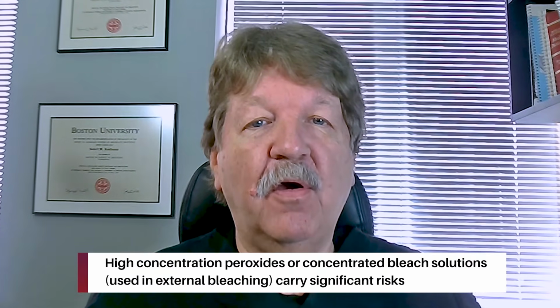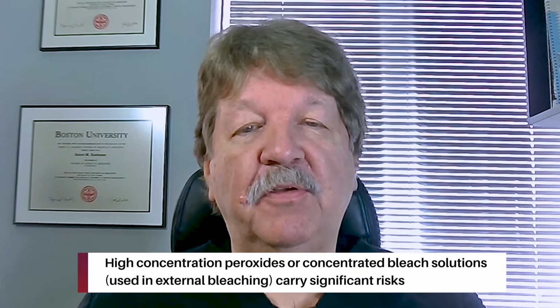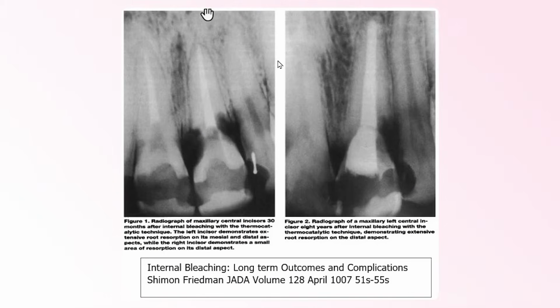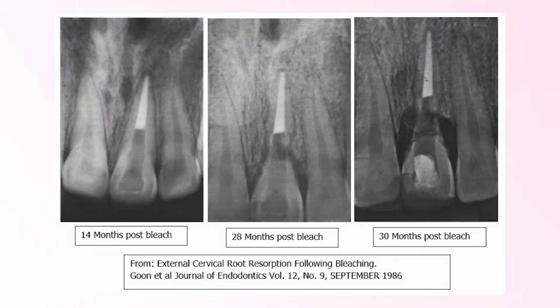After many years of research, we found that using high concentration peroxides, or some of the more concentrated bleach solutions that are used with external bleaching, has some significant risks. One of the most important risks we must be aware of is this leaching of the peroxide solution through the dentinal tubules into the pericervical area and the PDL. This can result in rapid, catastrophic, localized, or circumferential external cervical resorption due to the caustic nature of the peroxide. There's nothing more devastating for a patient than to undergo a trauma, then successful endodontic treatment, and then find out that tooth has to be extracted due to mismanagement of the bleaching procedure.